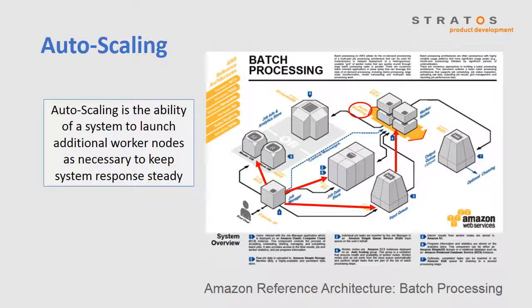This type of overloading can happen for many reasons. During recovery from a regional power failure, for instance, many devices can come back online simultaneously. The development team looks into the problem and finds that their platform as a service solution is missing an important architectural element, load balancing, which addresses overloading at the front end of a system. Load balancing, which we'll look at next, is another cloud best practice.